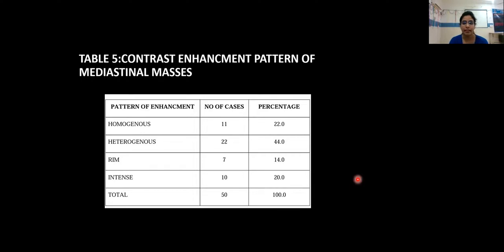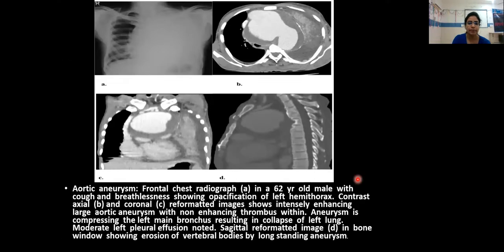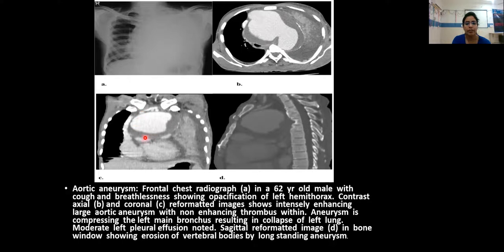These images show a 62-year-old male with cough and breathlessness, with opacification of the left hemithorax on radiograph. Contrast axial and coronal reformatted images show an intensely enhancing large aortic aneurysm with non-enhancing thrombus within. The aneurysm is compressing the left main bronchus, resulting in collapse of the left lung. Moderate left pleural effusion is also noted. The sagittal reformatted image shows erosion of the vertebral body by the aneurysm.